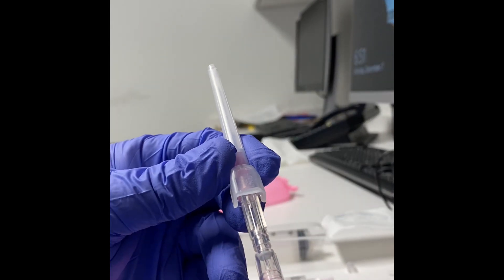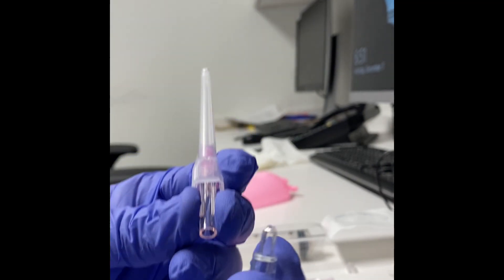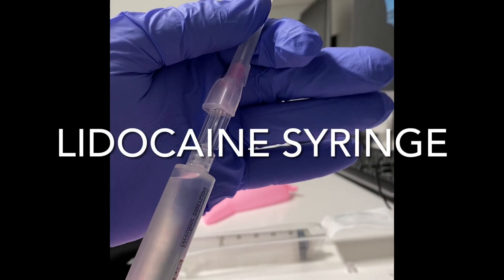The first thing you want to do when you open this is take the little cap off the back, because that prevents you from connecting anything that can aspirate. Take that off and we'll be ready to go.